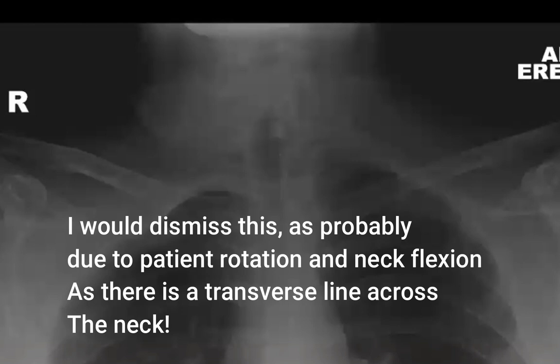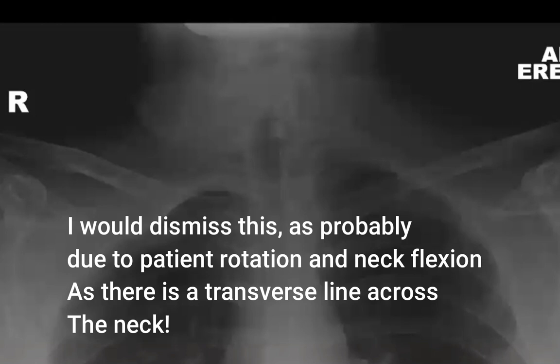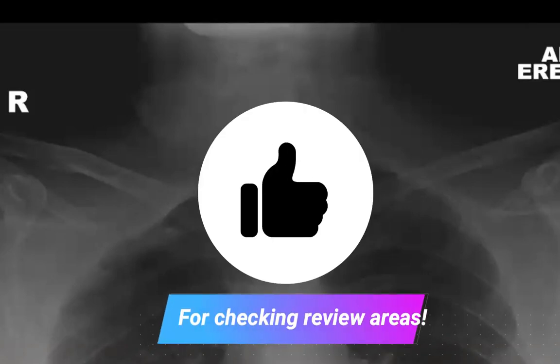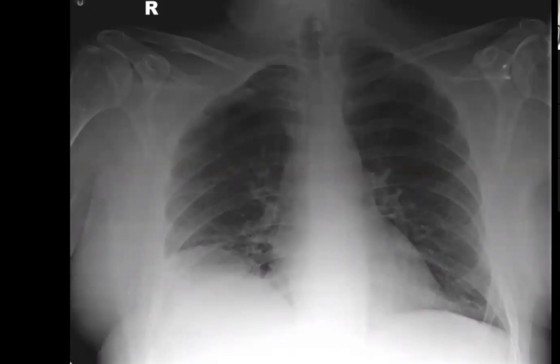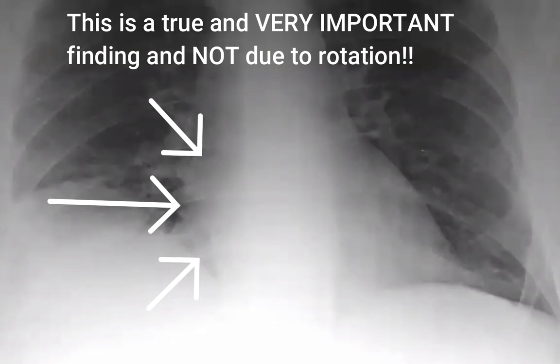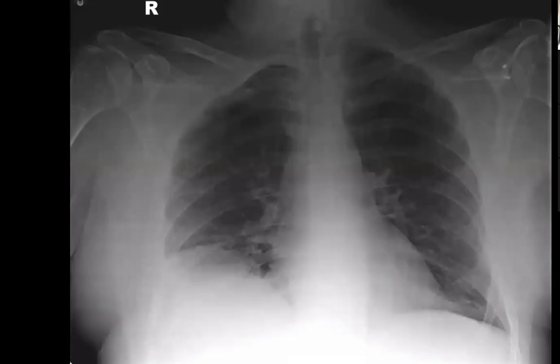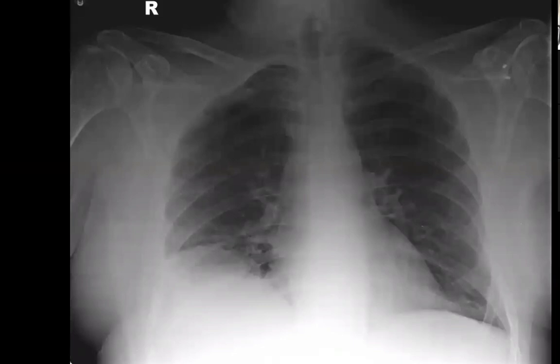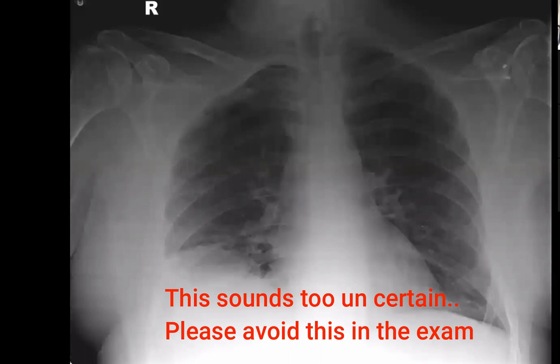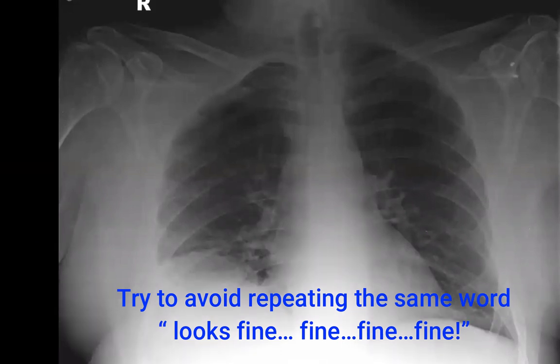There is also related deformity of the right upper thoracic inlet. I'm checking my view areas. The cardiomediastinal contour looks fine. There is a slight convex right paravertebral convexity — I think the film may be rotated a little bit, possibly the aortic outline. I can see a right paratracheal convex thickening, maybe a right paratracheal lymph node, or maybe it's related to the rotation. The airway looks fine.